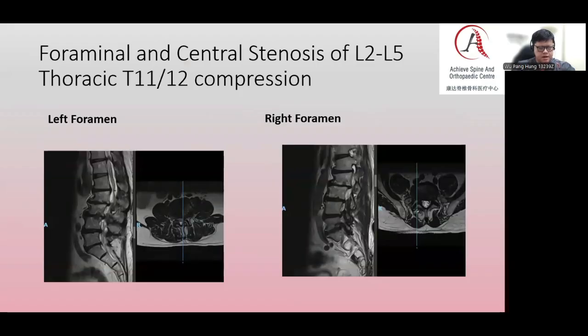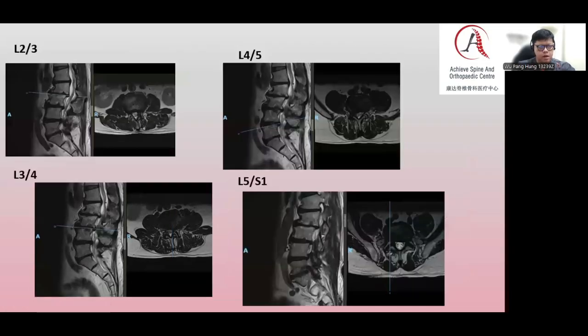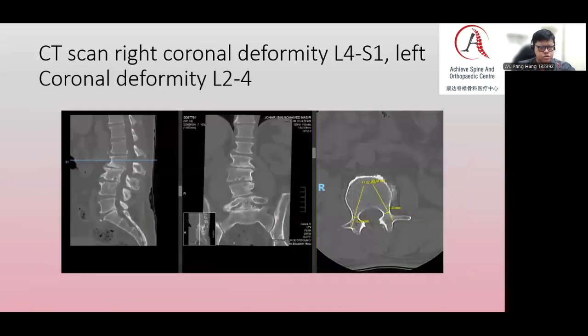And we can see that in the MRI, besides the left side L2 to S1, various severe spinal stenosis in the foramen as well as lateral recess. We also can see in some of the cuts that in the T11-12, there is a thoracic spinal stenosis with myelomalacia. Bear in mind, it's a lumbar MRI, so after we have obtained the cuts of the lumbar MRI, where we show L2 to S1 spinal stenosis, we also go ahead with CT scan as well as thoracic MRI.